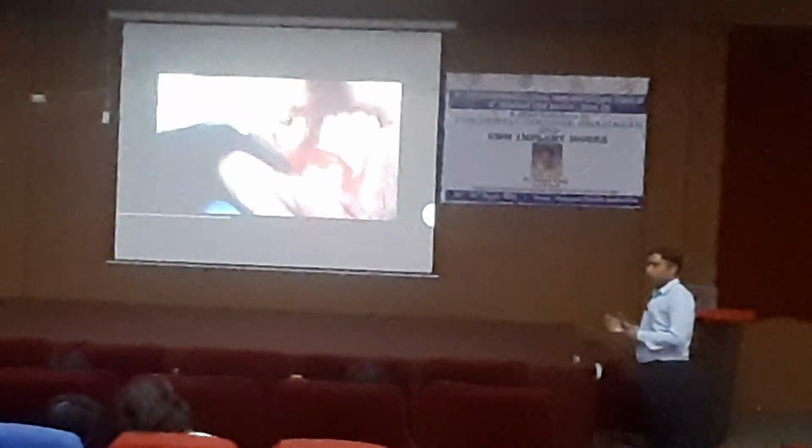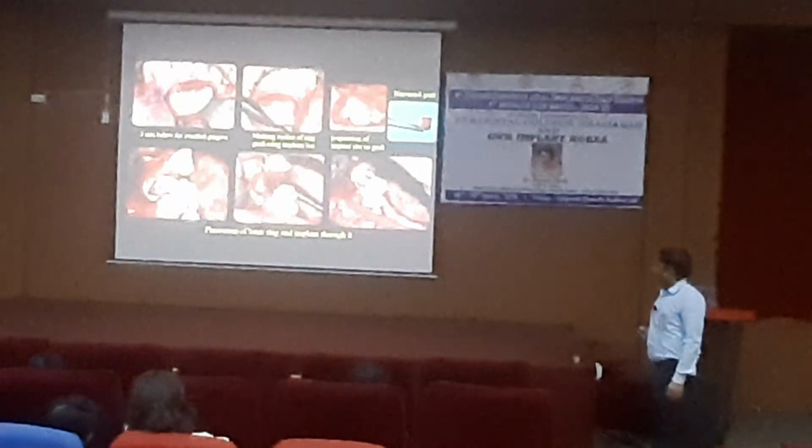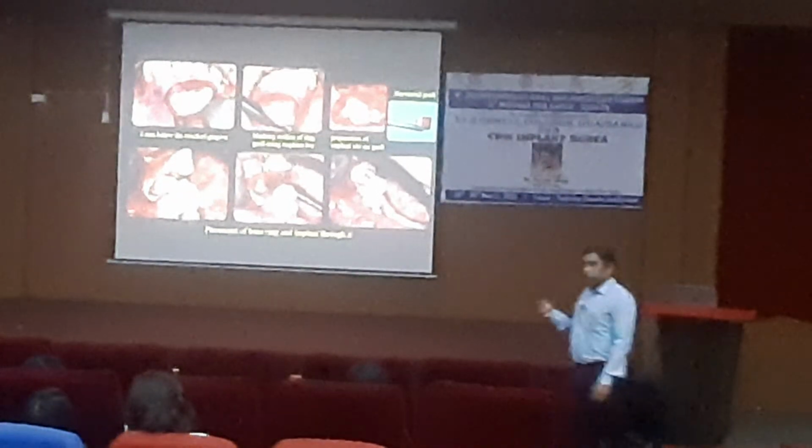That is the trephine, you can see the wheel turning. Okay, so full depth we go. This is according to the need, how much diameter and how much vertical height we have to augment. So this is the ring in the chin area. Okay, this is the patient, 3 mm below the attached gingiva of the chin area.